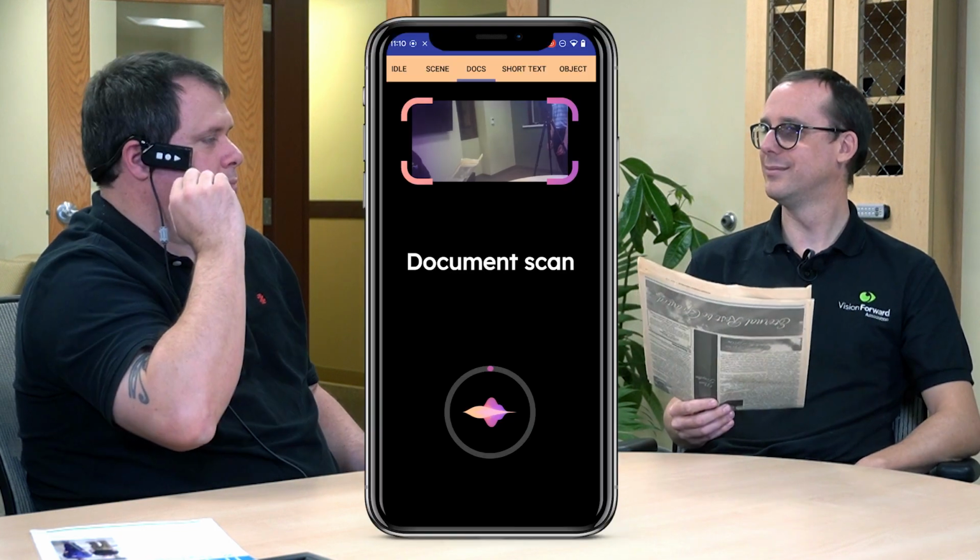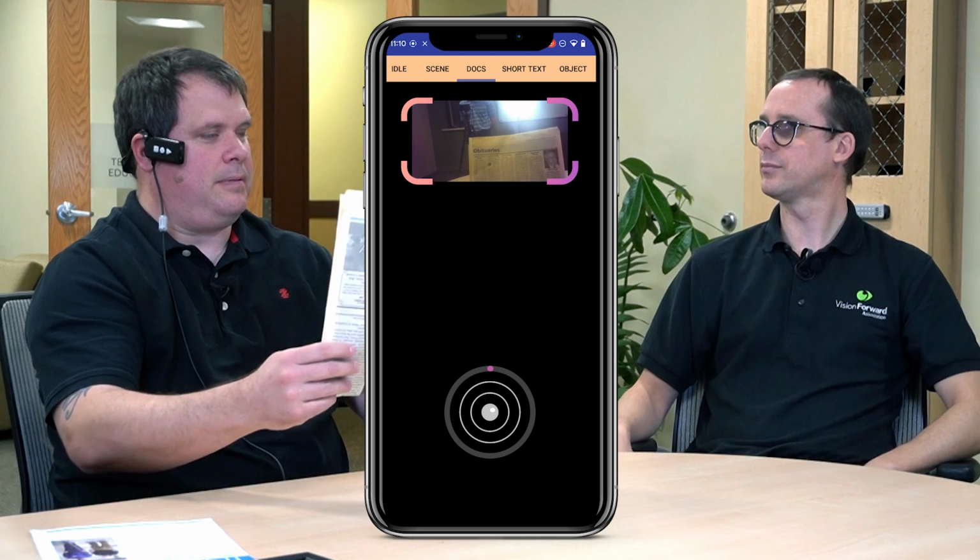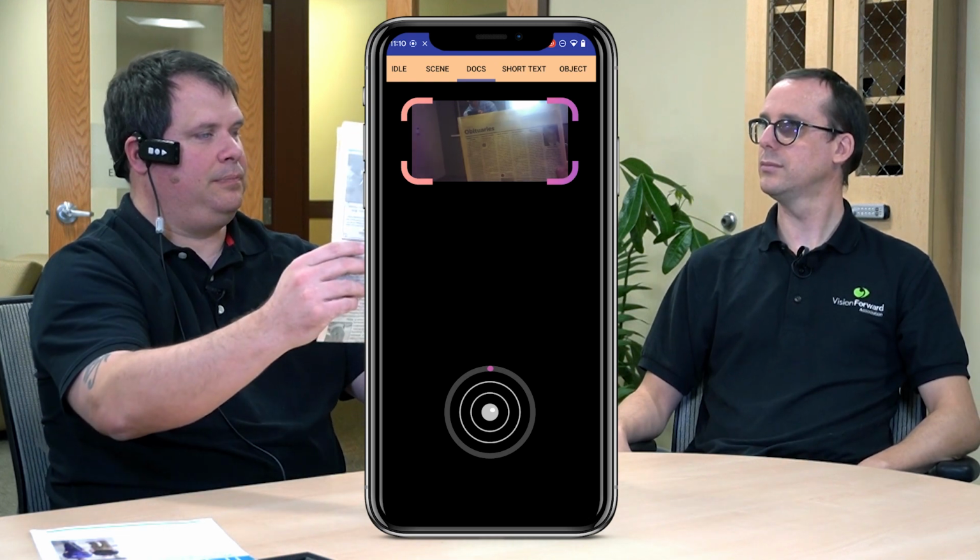So Cory, if you'd like to go into document mode here. Yes, I'm going to use my mode button this time. Document scan. All right. So far so good. Here is your document. Thank you. Raise document. Move left. Move left. Move right. Move right. Document aligned. Hold steady.